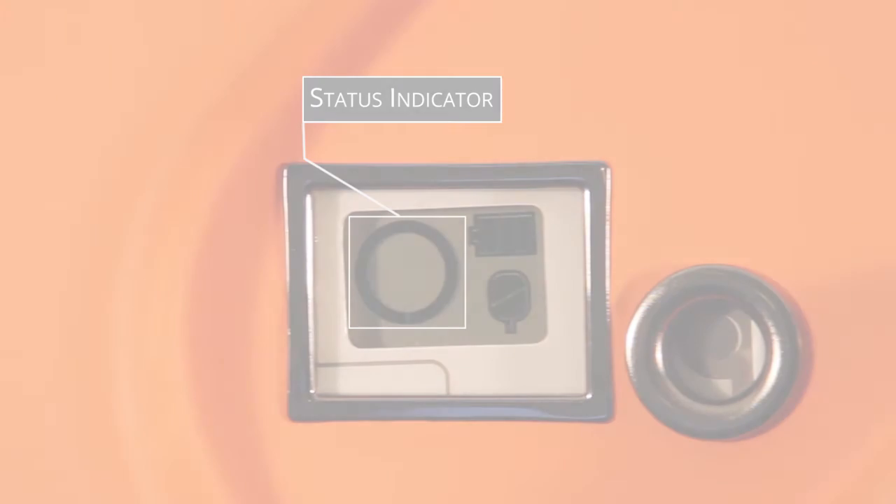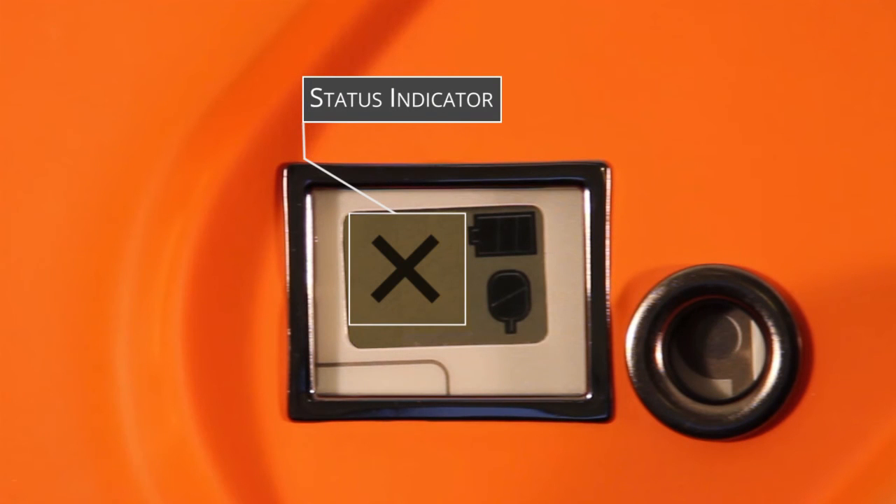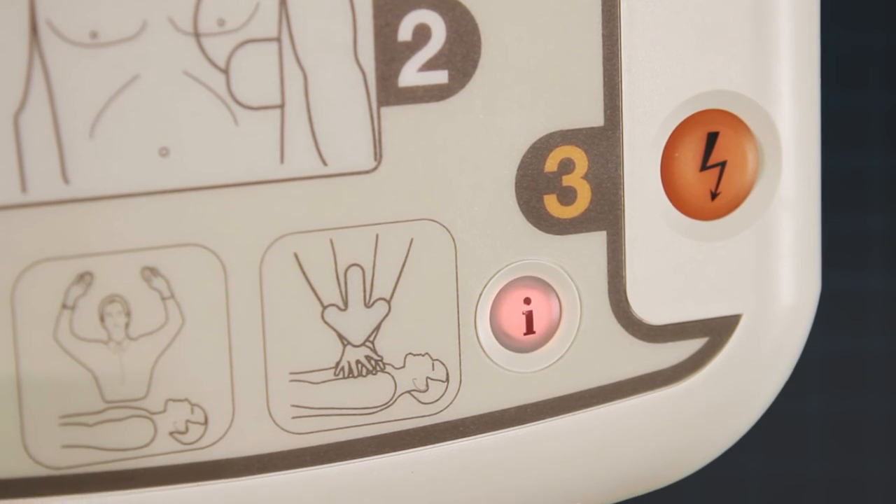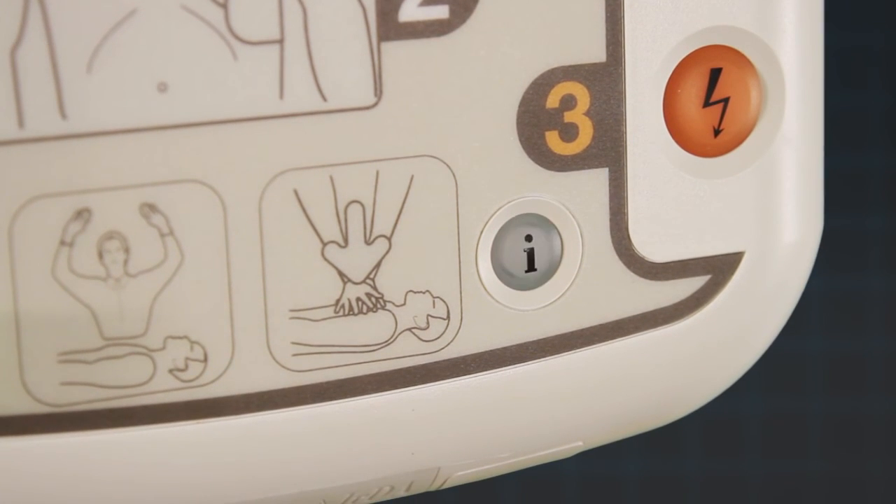If a problem has been found, the indicator will change to show a cross and the I button will flash red. Press the flashing red I button and the iPad SP1 will verbally tell you more about the issue.